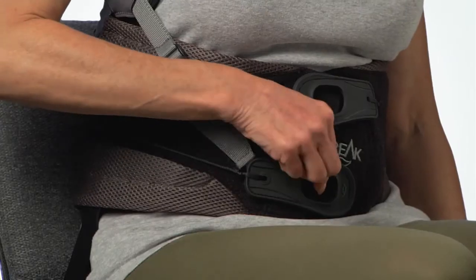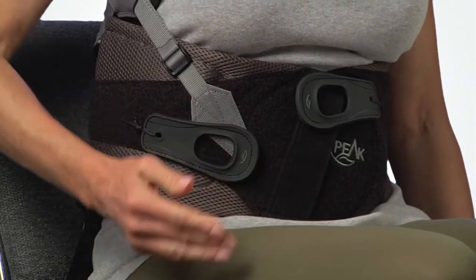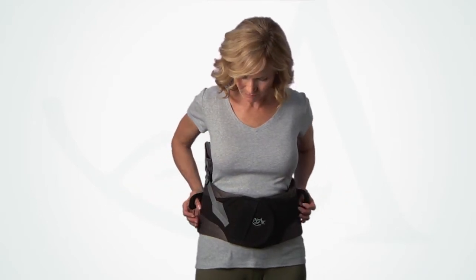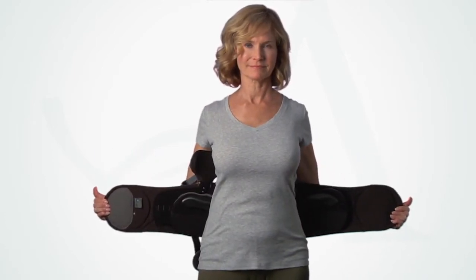To maintain effective, comfortable support while seated, it can be helpful to slightly loosen the upper portion of the brace by adjusting the right pull tab. Have the patient remove the brace by peeling up the pull tabs and placing them as close to the back panel as possible. Before removing, have them fully extend the brace so it is ready to go when they reapply it.